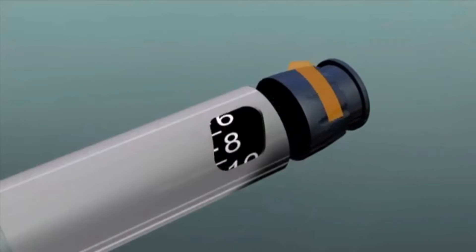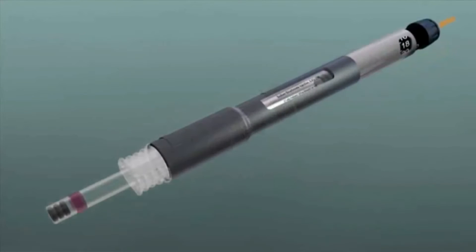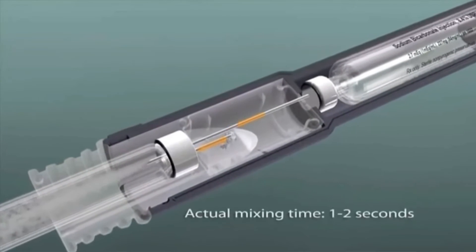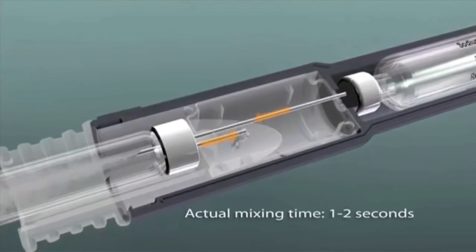The pen's cartridge chamber hosts Onpharma's sodium bicarbonate cartridge. The Onset Cartridge Connector attaches to the Onset Mixing Pen and contains two transfer tubes that provide a sterile path from the buffering cartridge in the pen to the anesthetic cartridge, and from the anesthetic cartridge to a holding reservoir.